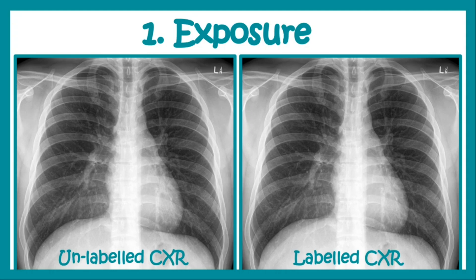First we check for the exposure — whether the exposure has been correct or not. We look for the lower thoracic vertebrae visible on the chest x-ray. On the left hand side, the boundaries of the lower thoracic vertebrae are barely visible. If they are barely visible, that points towards a proper exposure. If the exposure is more, there will be a more clear view of those boundaries, and in case of less exposure the boundaries won't be visible clearly.